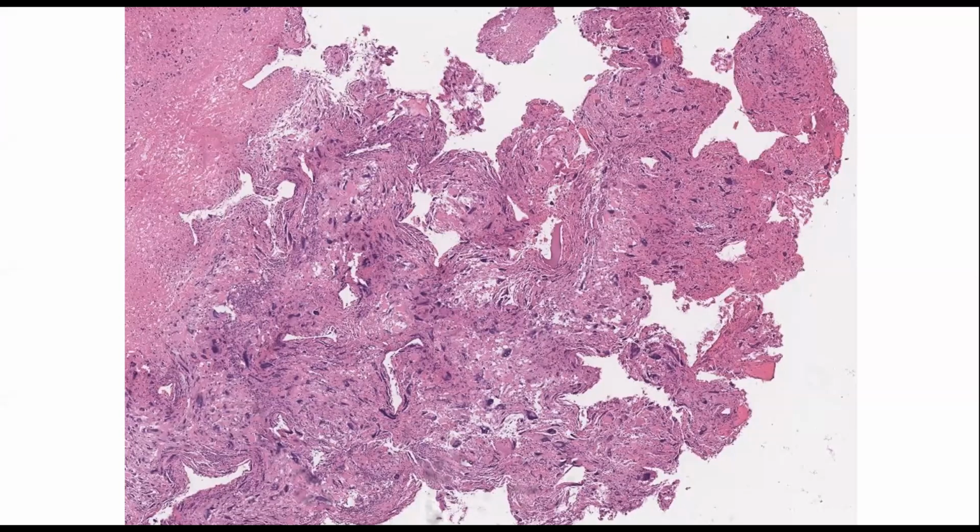So first you just see the little triangles. Then as the artifact gets worse or more pronounced, you end up with spheres, or in 2 dimensions, circles of tissue. It's very distorting in many ways, all right? Let's look at another case. This is a different case with exactly the same artifact.